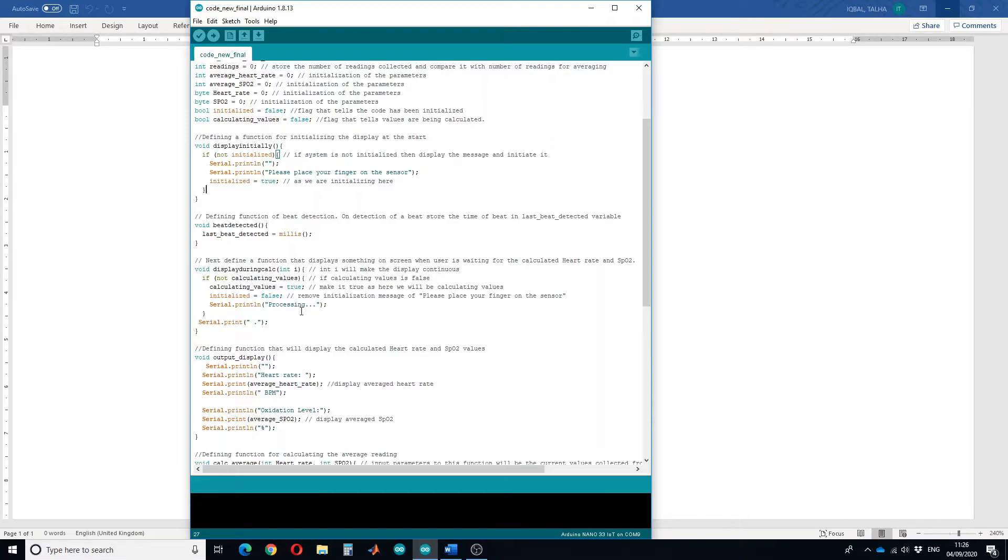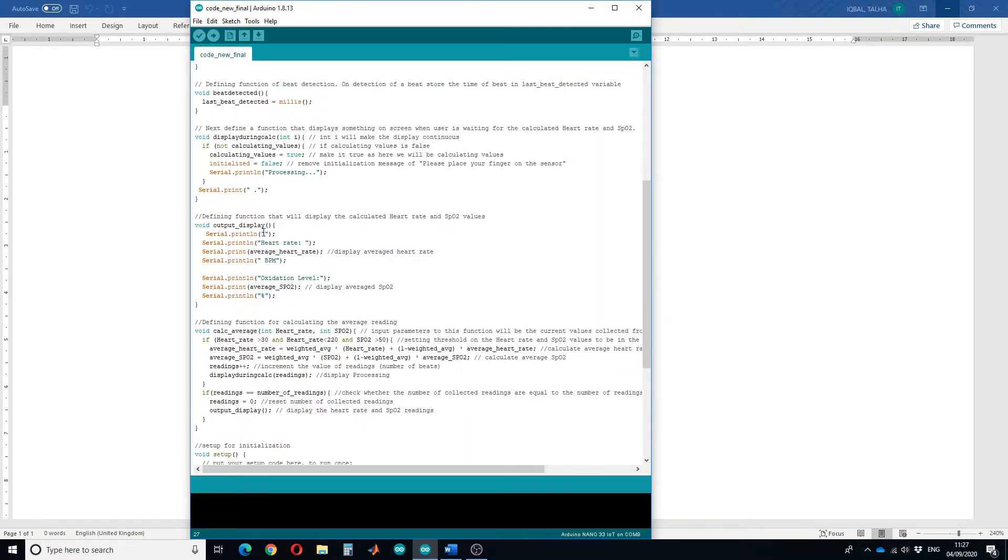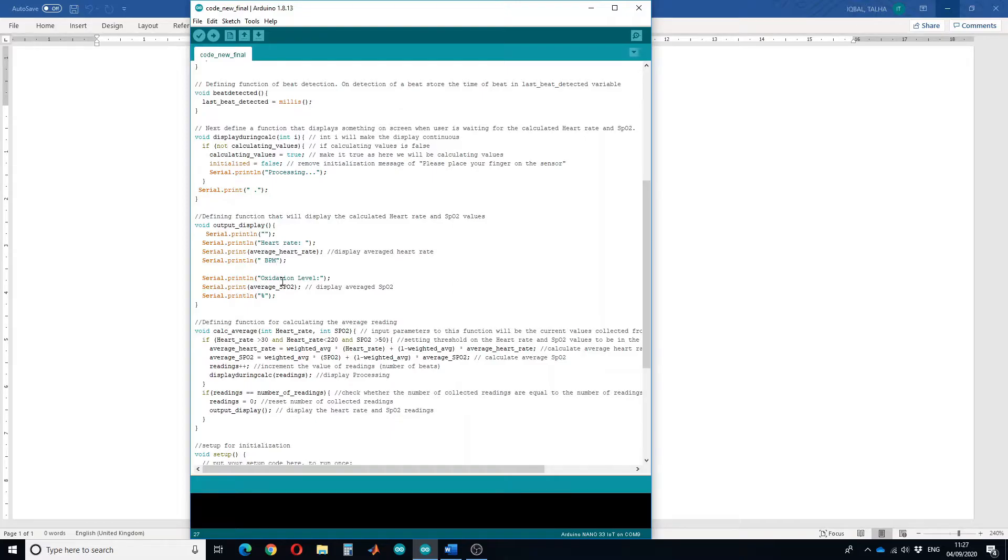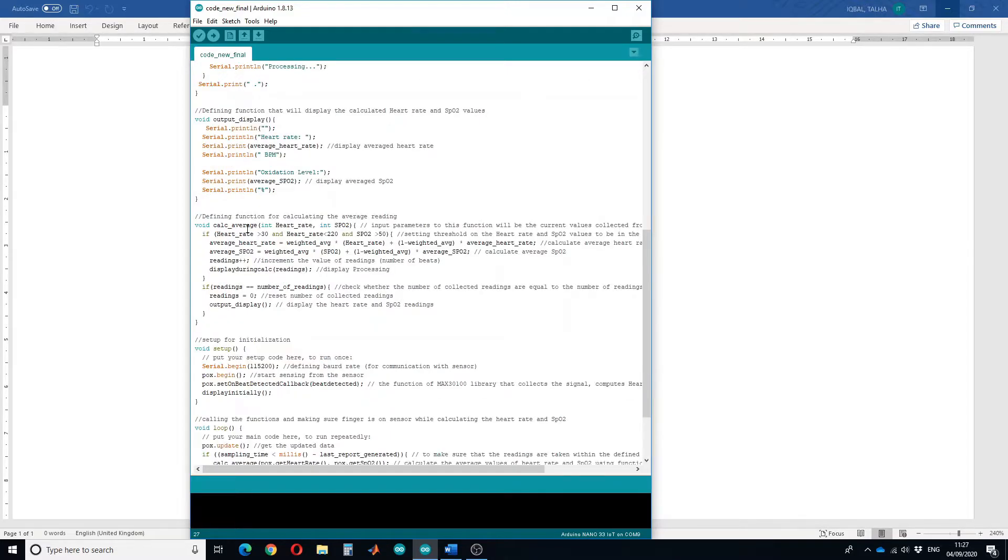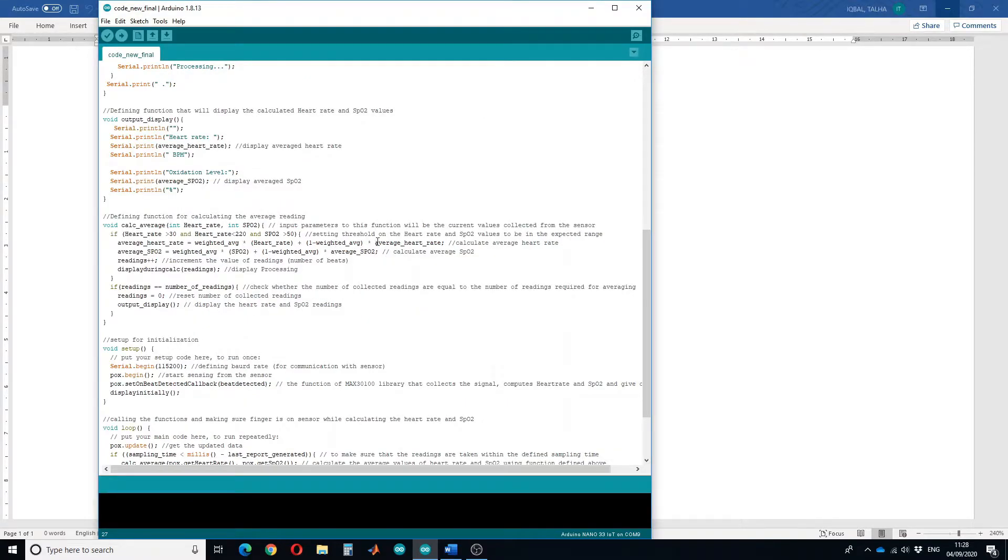The output display function displays the output values on the screen - it will display heart rate with the unit of BPM and oxygen levels with the unit of percentage. This function calculates the average. We have put a check on the values of heart rate and SPO2. We expect the heart rate to be in range of 30 and 220 while SPO2 should be greater than 50.